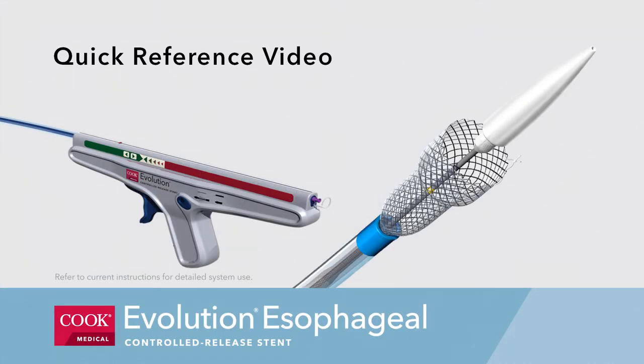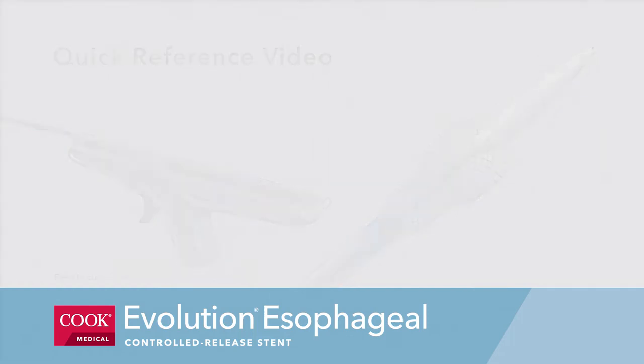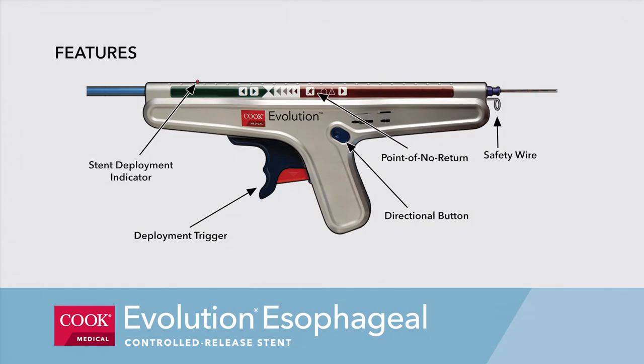The following serves as a quick reference video for the Cook Medical Evolution Esophageal Controlled Release Stent. Please refer to current instructions for use for detailed system use. Please note the features of the Evolution Esophageal Controlled Release Stent System.